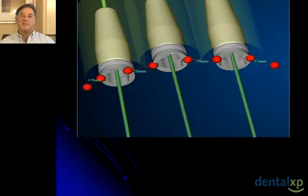of an implant, tooth to tooth, implant to implant, implant to tooth, pontic to implant, and so on. And these are well documented in the literature. Some of the articles by Salama, Tarnow, and our other dental XP experts have given us this information, and you should download those articles. But in this particular patient, I wanted to be at least 2 millimeters from an adjacent tooth, and I wanted to be approximately 3 millimeters implant to implant.